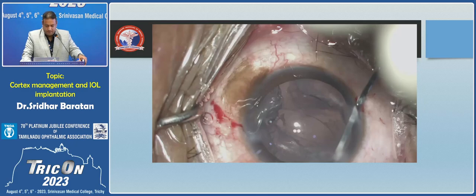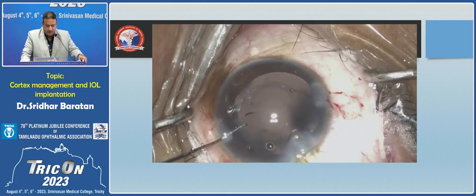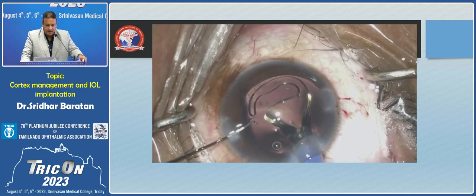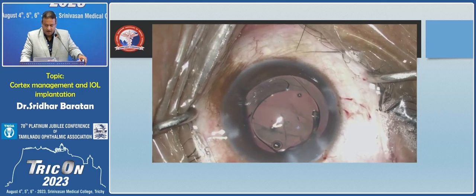Just this last one, a particular presentation in a case where you have a PCR, you can see that the haptic is being brought in horizontally. And once it is placed inside, you can actually inject this beautifully into the bag without having any further complications.